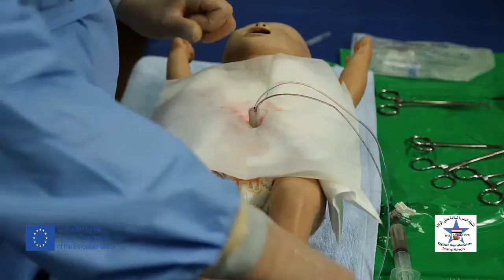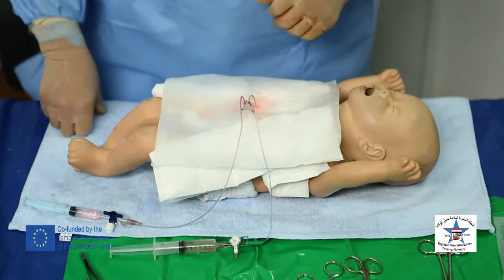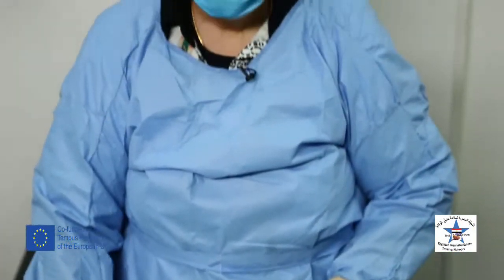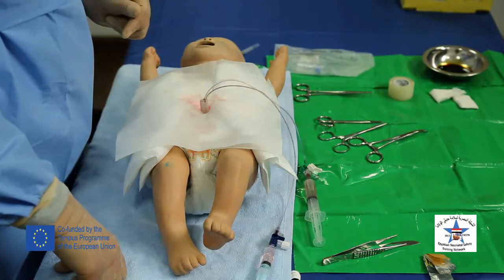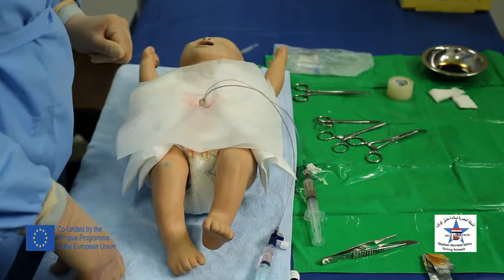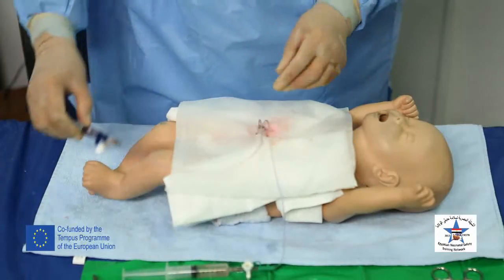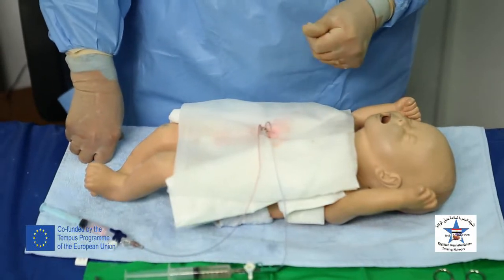Now we have to connect the catheter to heparinized saline in a concentration of 0.5 units per 1 ml with a continuous infusion of 0.5 to 1 ml per hour to keep the umbilical arterial catheter patent and prevent the formation of blood clots. Confirm the position of both umbilical arterial and umbilical venous catheter radiologically.